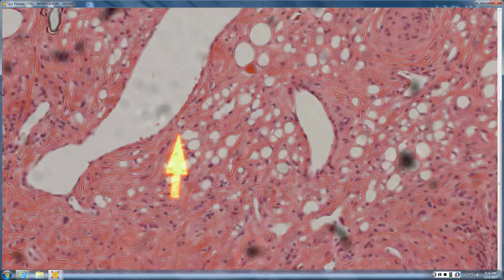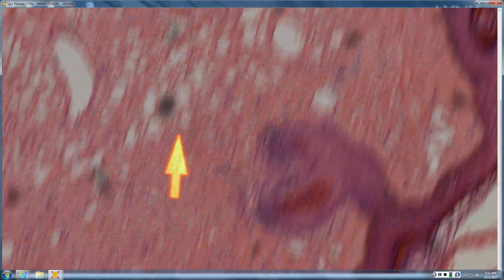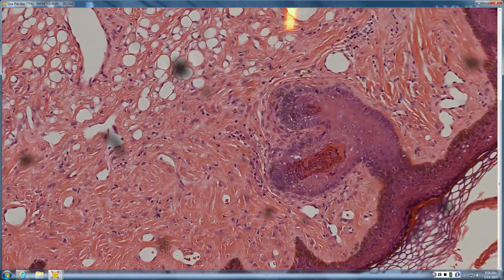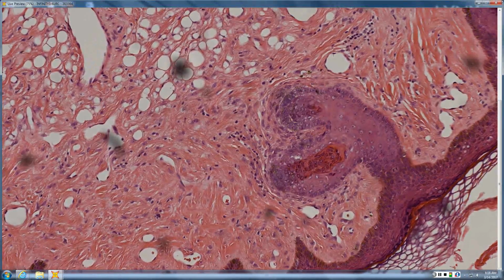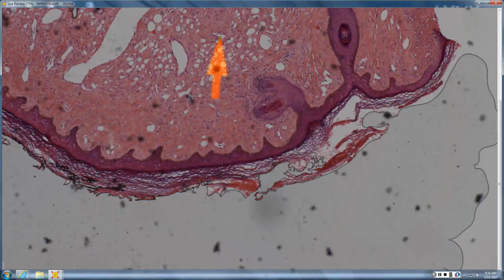Okay, well, unfortunately, we got a couple of air bubbles here. But let's look around the air bubbles and tell me what you got here. Looks like a bunch of vascular spaces or lymphatic spaces. So some of them are endothelial lined and are absolutely little vessel spaces. Others are probably xylocaine bubbles. So any fibrous tumor, anything that's hard or sclerotic, when you're pushing the xylocaine in, you can get little bubble-like spaces.